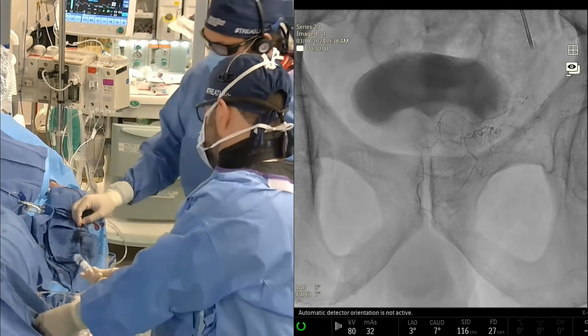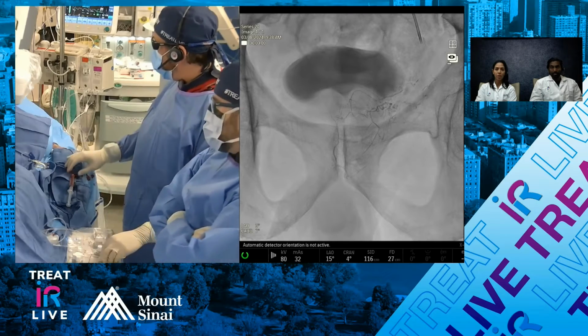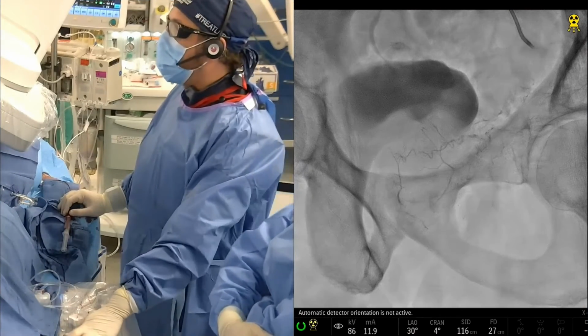Yeah, that's just a huge improvement in terms of the time, the 3 cc that it took. I mean, you can't compare that with particles. No, we've all done those cases, and it's much faster.